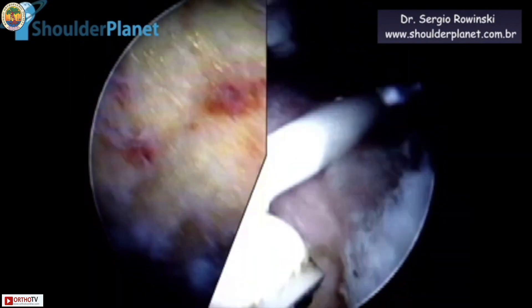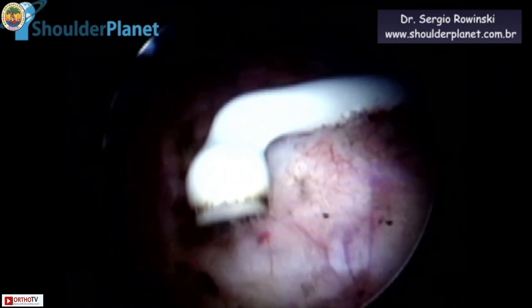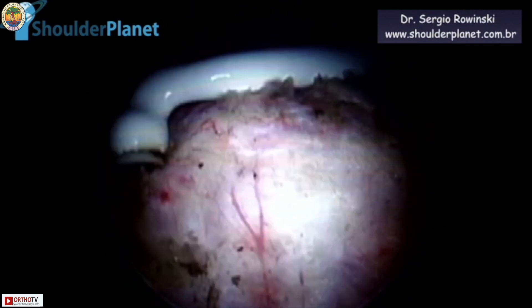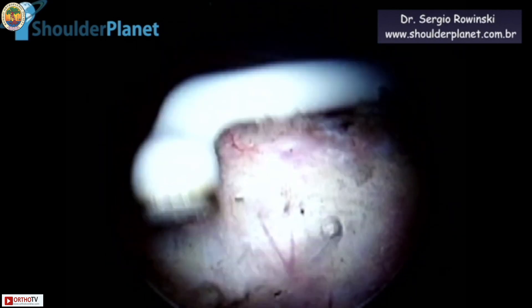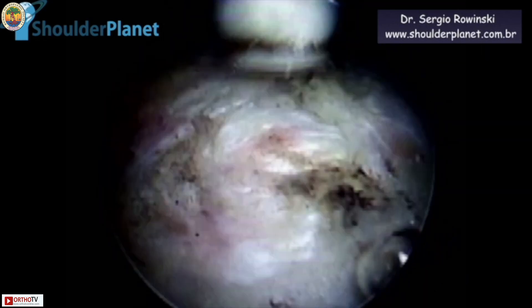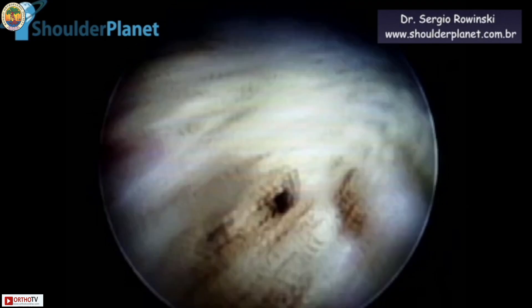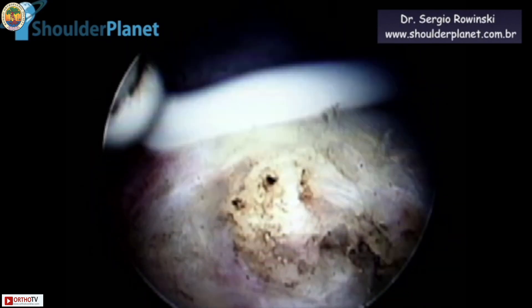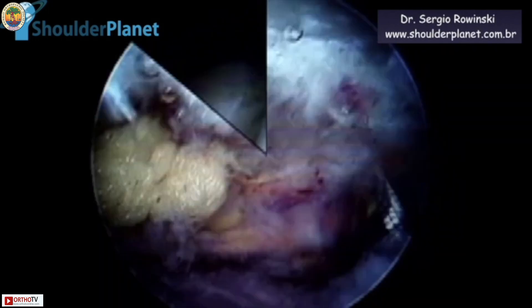After that, we look at the tendon. We are working through the anterior portal, watching through the lateral portal. On palpation, the tendon was quite in a nice state. We are performing just a slight probe of one of the bursal-side signs, just above the most upper fibers. The posterior superior cuff was in a very nice state. We are making the final palpation with no signs of lesion. At that moment, we proceed to the main demand surgery itself.